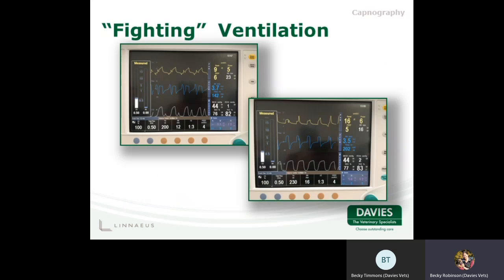Now, we can see in this example, in the picture on the left, we have some relatively normal looking capnograph traces, which are relatively square, giving an end-tidal carbon dioxide of 44 millimeters of mercury. And then we have the much smaller waveforms coming pretty much after every single ventilator breath. This is the patient trying to breathe spontaneously in between the ventilator.